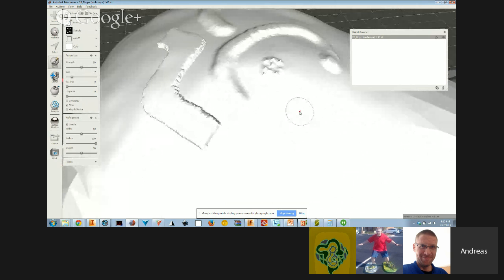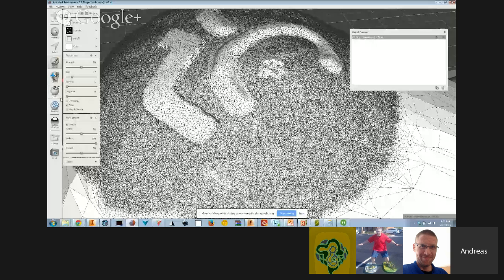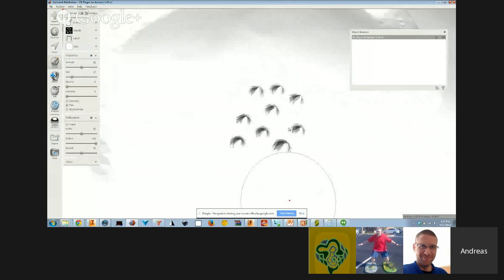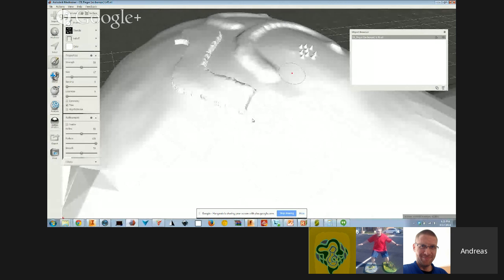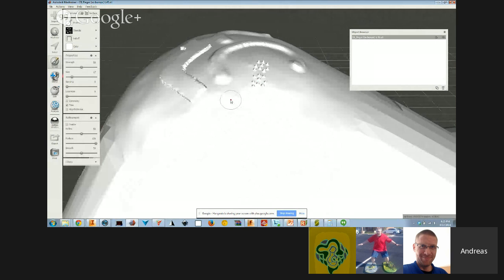When I do this, you noticed I had refine on, so what I want to do is undo that and just turn off the refine, or enable refine, turn that off. And now I should get something a little more predictable there. So now I have these little bumps that I'm adding as a little tactile, I don't know, might be useful to have on a finger. And depending on how big your brush size is, you can add, oh, I did a very big one. Hang on a sec.